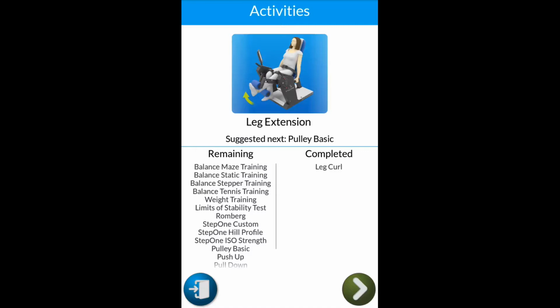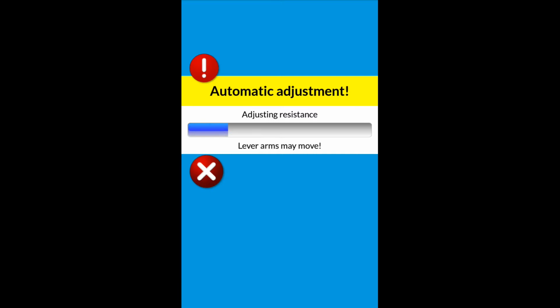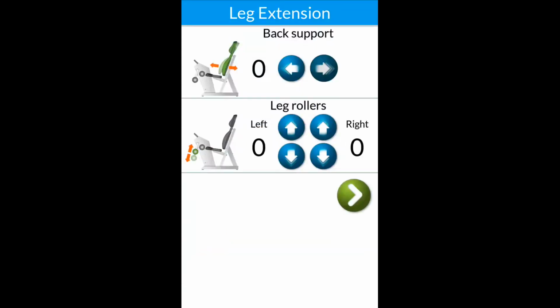After the activity is completed, the finished activity will show on the right side of the screen under Completed. Then you can perform the next activity for that particular machine if there is more than one, or exit altogether. With the next activity selected, you can repeat the process by selecting the green arrow icon. If at any time you need to adjust the seat height or lever arms, you can select the blue adjustment icon and make the changes.